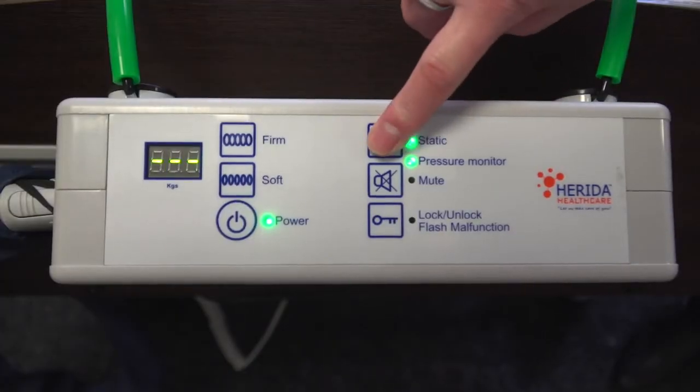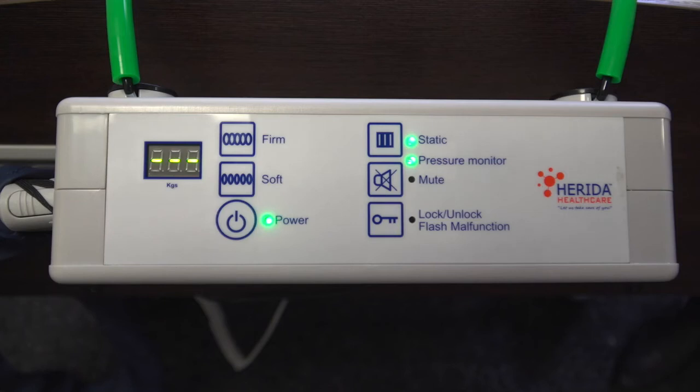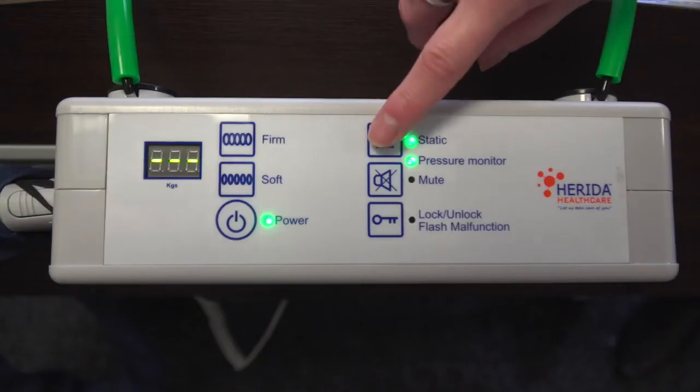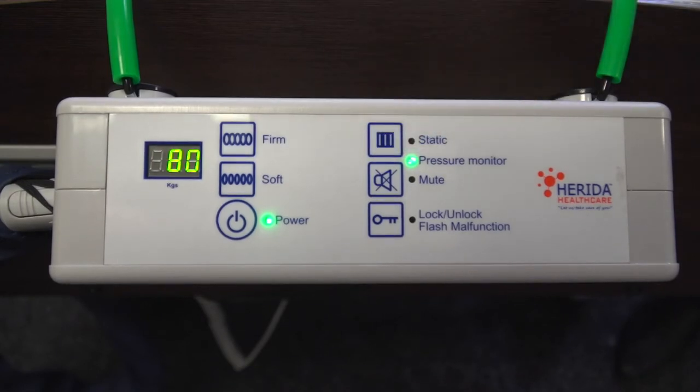Pressing the static button on the pump's control panel will stop the alternation cycle and both sets of cells will remain fully inflated. When the static button is activated, you will see the top LED light and the pressure monitor light illuminated. Static mode allows clinical procedures, site transfers, or any other procedure to occur. If static mode has been selected, as a safety function the system will revert to the alternating cycle after 25 minutes. It is better to manually revert once procedures are complete, but the automatic function is there as an additional feature. Simply press the static mode button again once the panel is unlocked to switch off static mode.